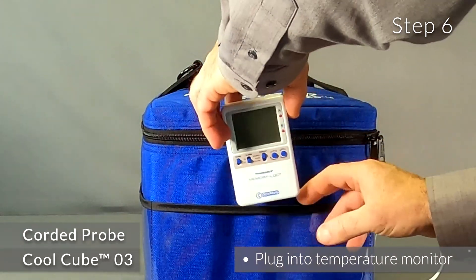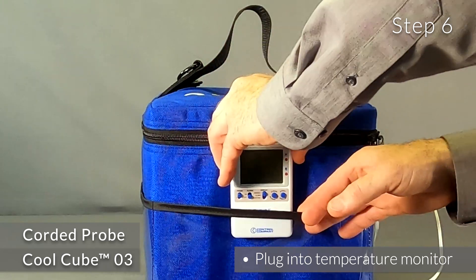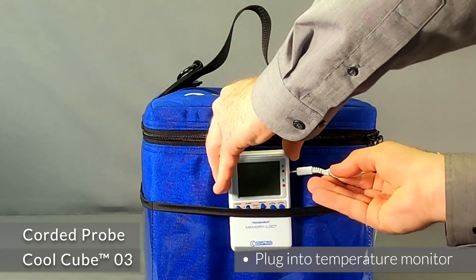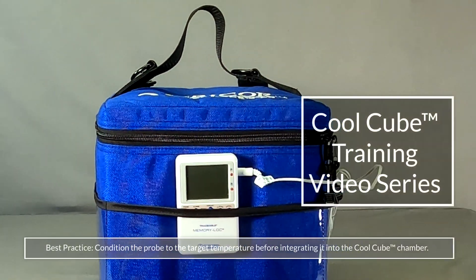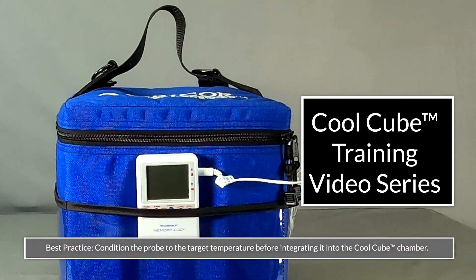Step 6: Plug the cord into the temperature monitor and place it in a pocket of the CoolCube. That's it! Quick and straightforward. Now go enjoy the peace of mind the CoolCube brings.